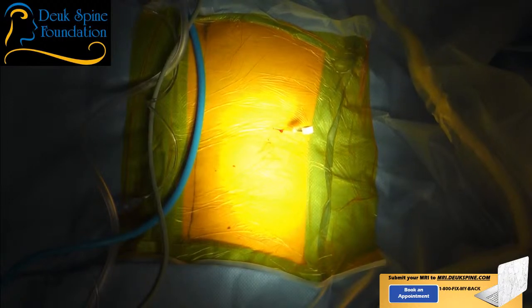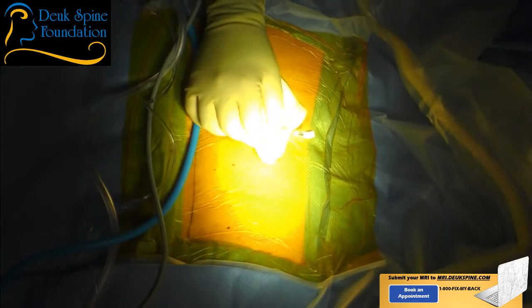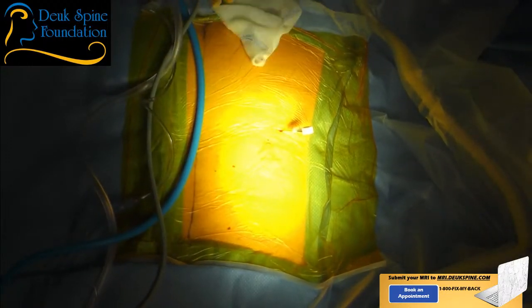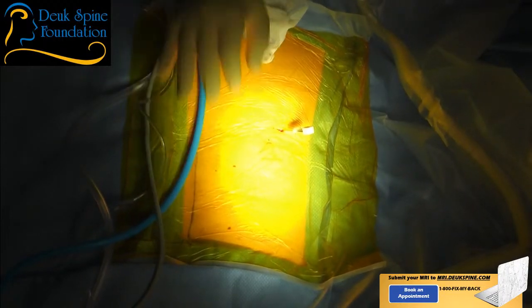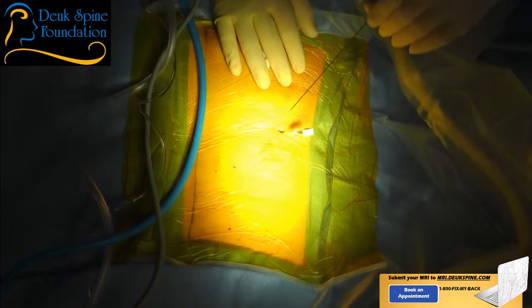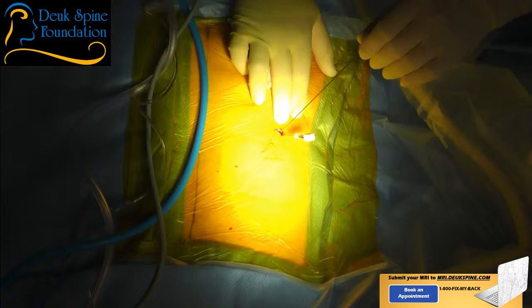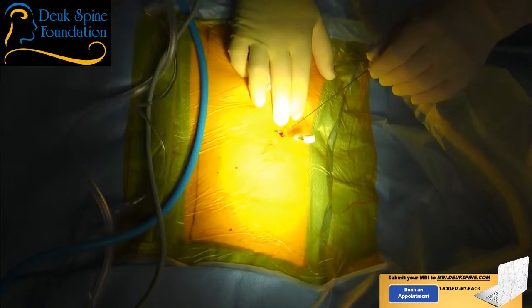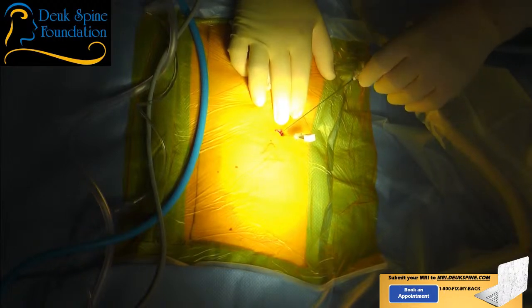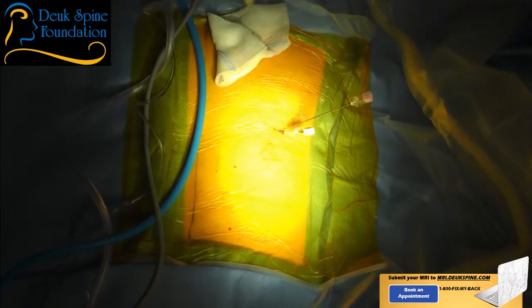Oh, you've done these, right? No. So I apologize. I'll just tell the audience, what we're doing here is we're fixing 3 discs. So we have to access all 3 discs. We have to navigate from the outside world, our point of entry, which is right here. This is like a point of entry, our port. It's like a little airport here where all the needles are taking off from. And we're going to get into the 3 discs. Now I may have to make a second incision depending on the curvature. It's not uncommon with such severe scoliosis. But we're going to try to get them all from here.